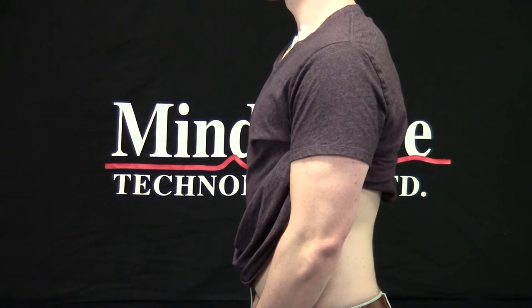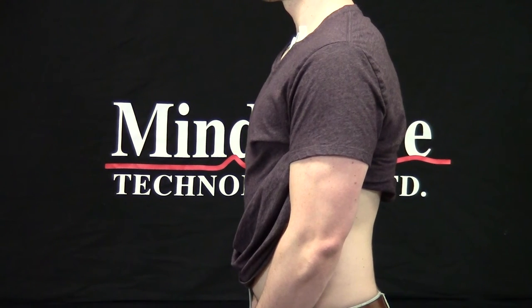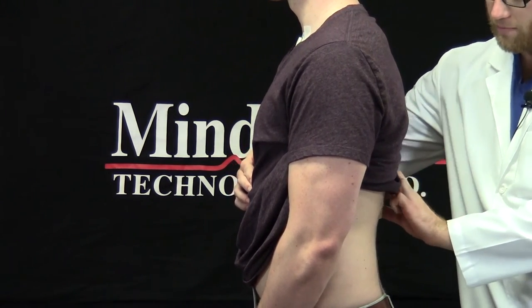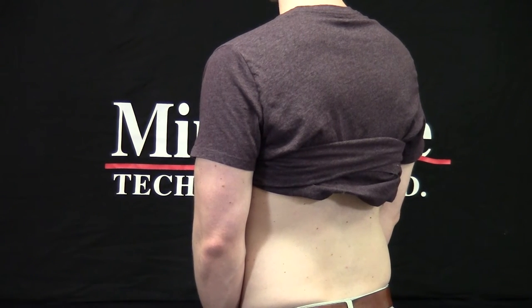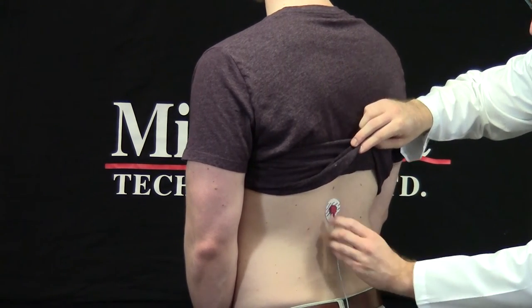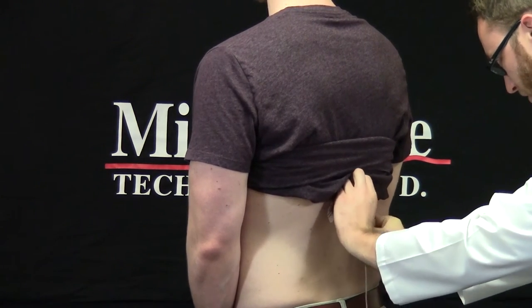Since the subject already has their shirt lifted up, I'll go ahead and place the negative CCS lead which goes on the lower back. The placement of this electrode depends on the location of the negative sense lead on the chest, so I'm going to have the subject turn so their side is facing me. I'm going to place my finger on the negative sense lead and estimate about an inch and a half down from it on the lower back and clean that site with the alcohol prep pad. Next, I'll take another electrode, this time with a red lead wire attached, and place it on the site I've just cleaned. Finally, I'll take my micropore tape and make a service loop.